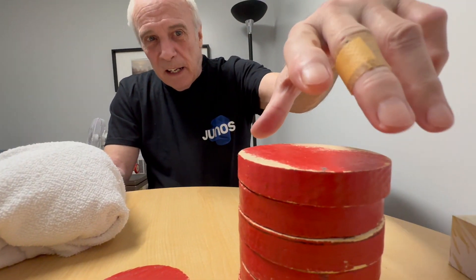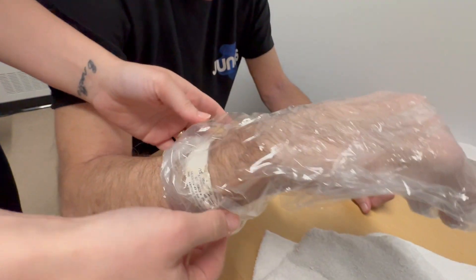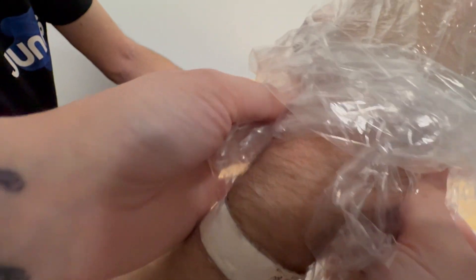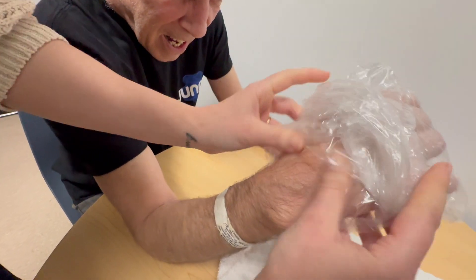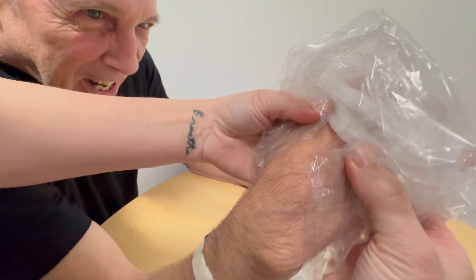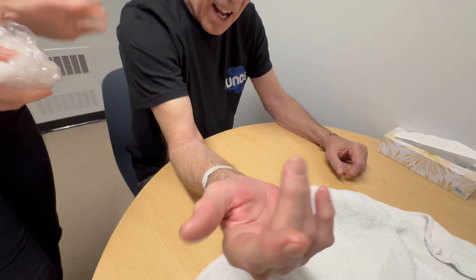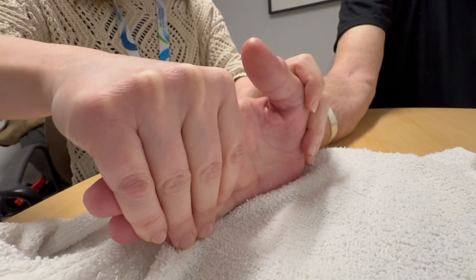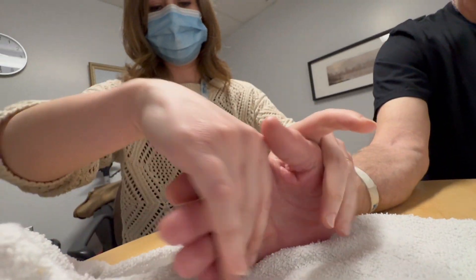This one is about spreading the fingers so I can get these. Put them down — I'm good at it, I can stack them like a pro. There it is, in the plastic. You just lift your wrist up a little bit there. You can see underneath how it's peeling off — it just comes off in one big wax glove. And this hand is super soft afterwards. This is a stretch you've been working on yourself every day. In therapy I help give you a real good stretch through this joint here — this is the really stiff area.